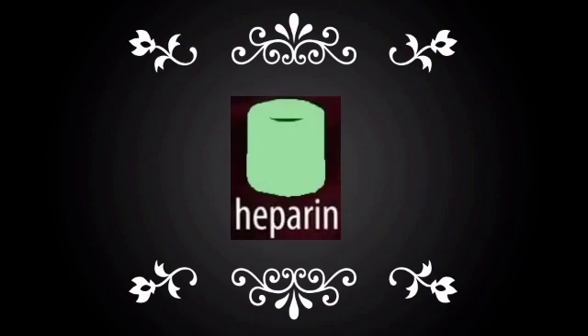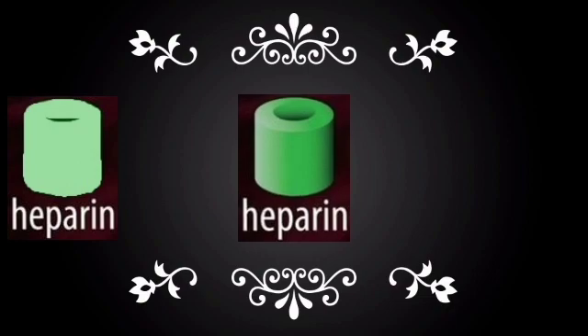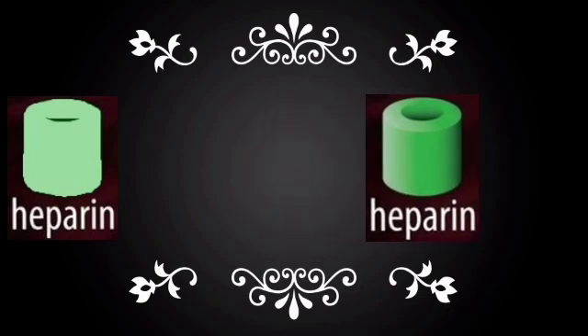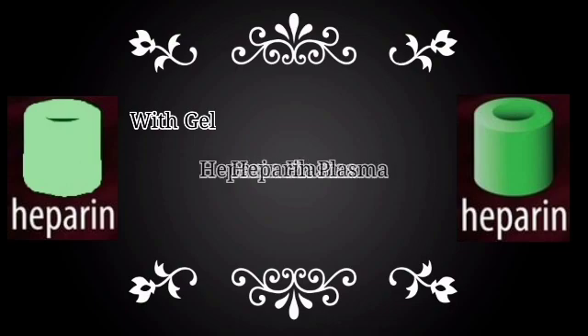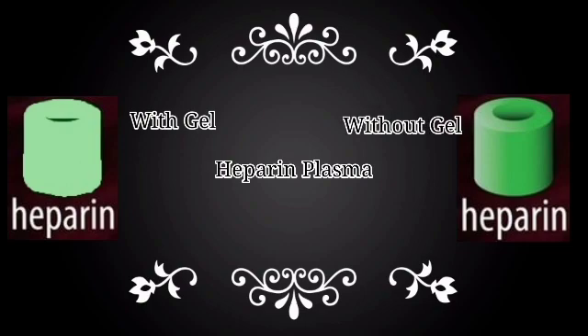After that there are green tubes, which are of two types: light green tubes and dark green tubes. Light green tubes contain a gel separator and are used for separation of heparin plasma, while dark green color tubes are also heparin tubes but without a gel separator.